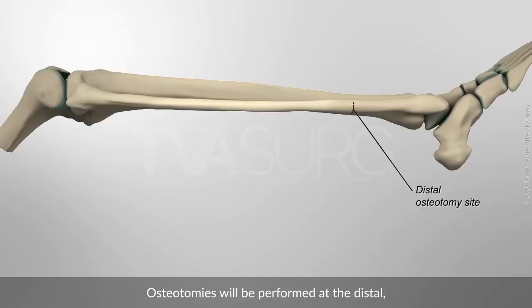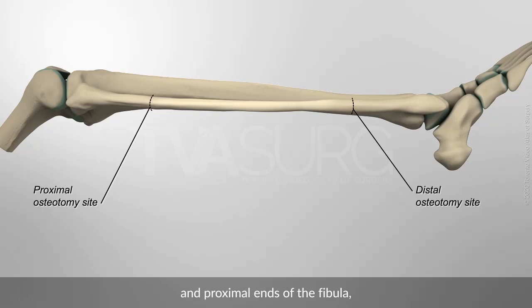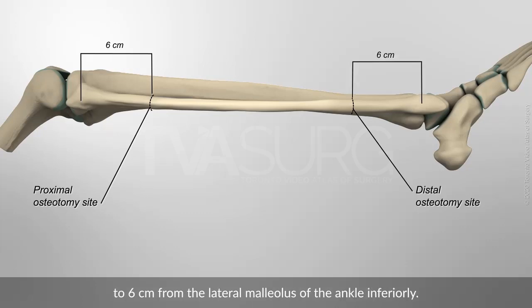Osteotomies will be performed at the distal and proximal ends of the fibula, 6 cm from the head of the fibula superiorly, to 6 cm from the lateral malleolus of the ankle inferiorly.